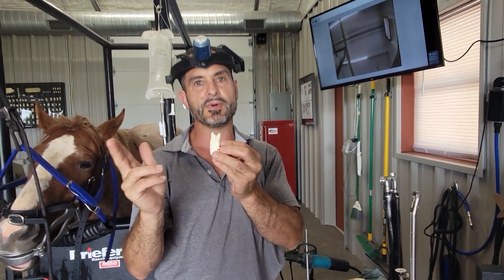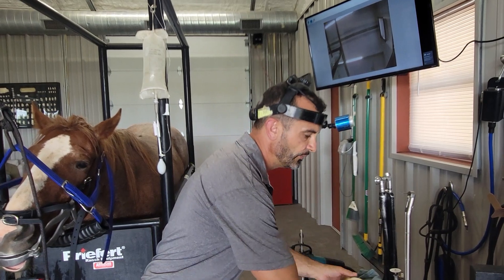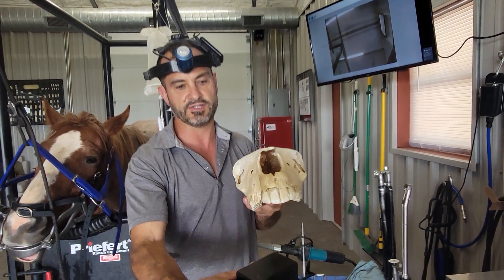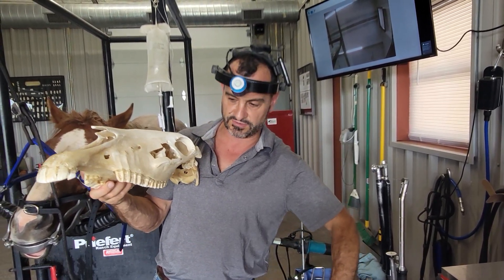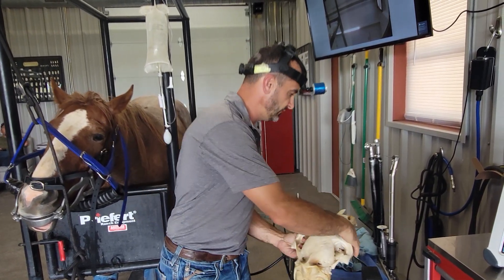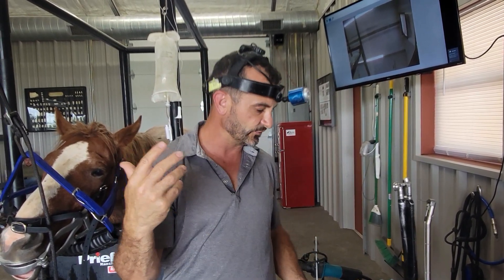What we have to do is an open mouth ventral to dorsal palatal view. We open the mouth with a block — all dental radiographs should be taken with a block in the incisors to separate the cheek teeth. The generator stays on the same side but goes ventral to dorsal and shoots up. The single palatal root gets raised and the two buccal roots drop. That gave us the right information to diagnose a periapical abscess, and the tooth needs to be extracted.